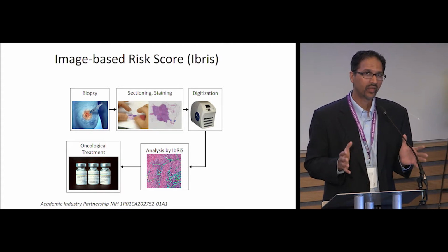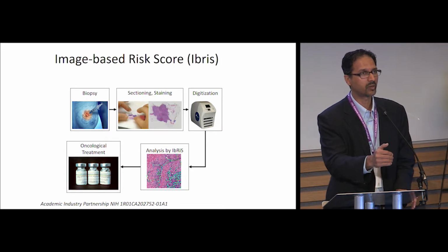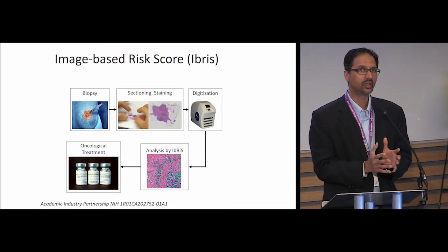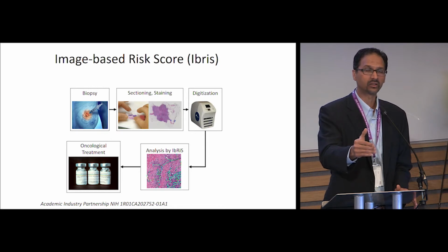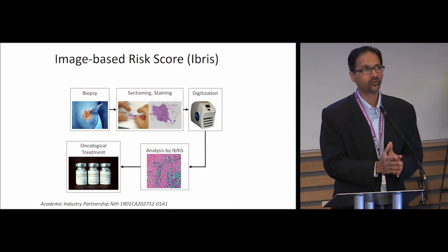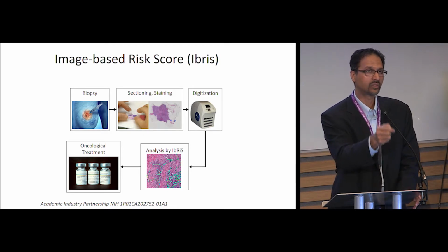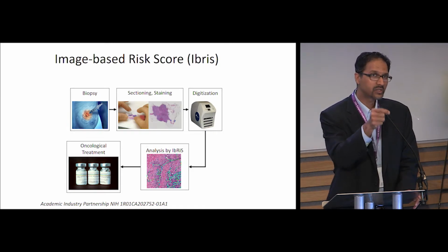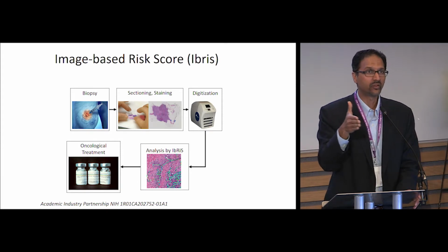And so therein, we started to really think about how we could look at digital pathology and AI, not solely from a diagnostic standpoint, but really asking the question, how can this benefit a clinician? Can we think of computational analysis of digital pathology as its own companion diagnostic? Can we think of this process of using AI with digital pathology to mine patterns and features that now just don't tell us about the presence of disease, or even the prognosis of the disease, but specifically, can we start to think of it as a way to predict added benefit of adjuvant chemotherapy?